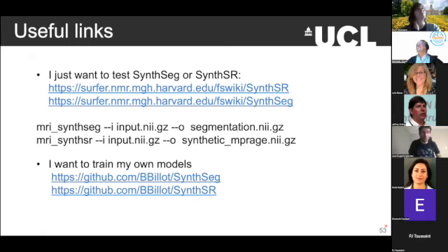But what if you had lesions manually labeled, but you wanted to ultimately use the data to do surface-based stuff? So you're running into the issue that FreeSurfer will break if there's a lesion because it can't reconstruct it and segment it. I think you're more familiar than me with this problem. I thought that people did lesion filling for this matter, right? Yeah, they do, but I don't think it always works.